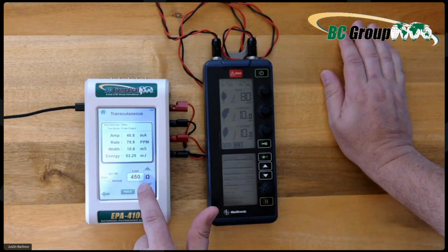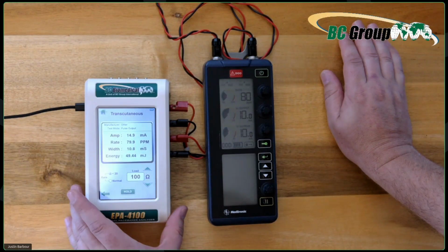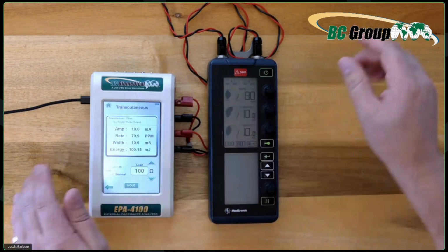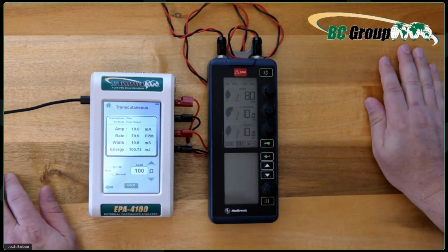But because I have this on a generic pacemaker, let's go ahead and take it down to 100 ohms. That's going to be pretty common for transcutaneous. Remember, transcutaneous means it's on the skin, so you're pacing through the skin, not direct. That means that your ohms is going to be pretty low.